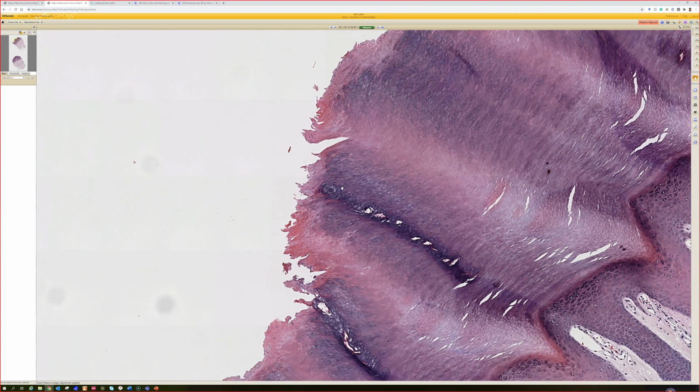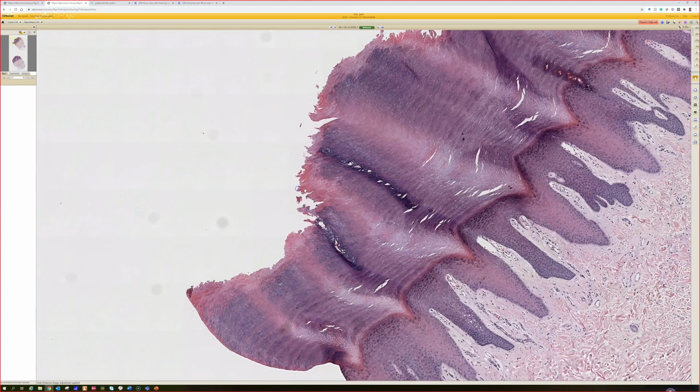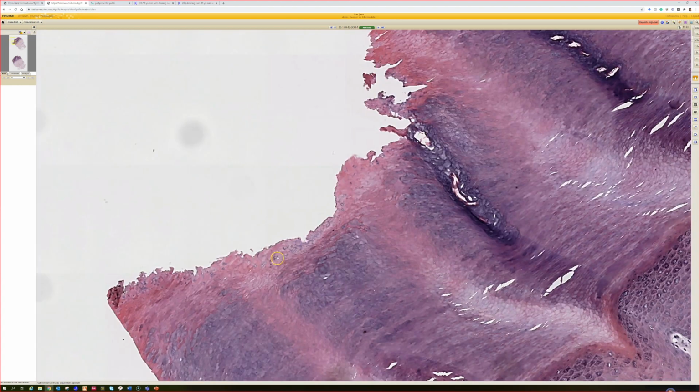And I believe this is most common on the plantar foot in hot, humid, tropical type climates. So probably something to do with occlusion and then the environment, and then the bacteria grow there and begin to eat in. And clinically, it makes a scaly change to the foot with all these little pits and holes in the corneal layer. So pitted keratolysis, kind of an unusual and interesting form of bacterial infection.